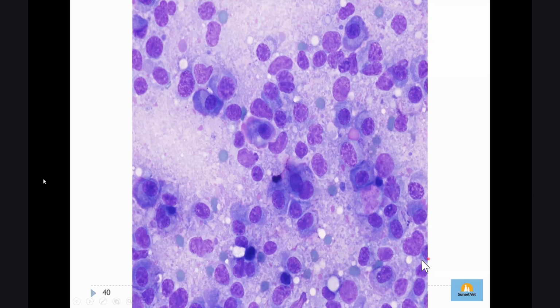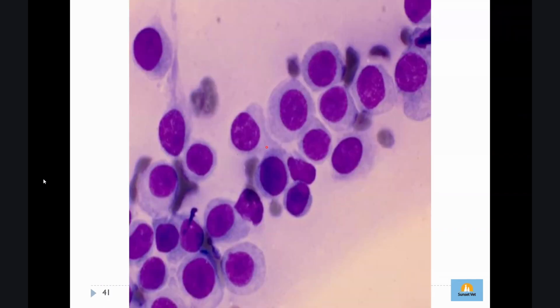Sometimes you will think, why is it not as easy? Why don't you think it's another one, doctor? But yes, it takes time, because you need to see it from the whole picture. Okay, I noticed there are flame cells here. Okay, that's typically plasmacytoma. Then how about this one? Inflammation or cancer?